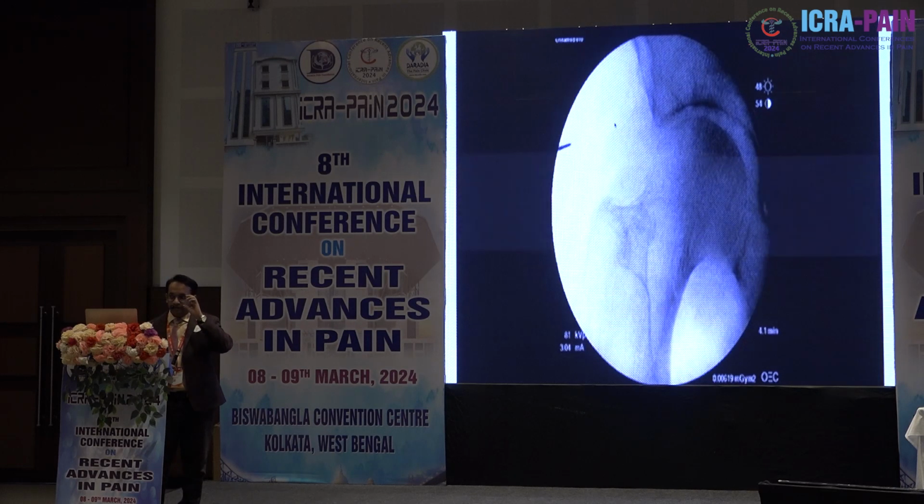Here we are going to target the acetabulum, the upper portion over here. Where my laser is pointing is going to be the target for it. We are going to use a fluoroscopic approach. Of course, I always combine the approach with an ultrasound as well. This is called a hybrid technique, which helps us stay away from the vasculature. Preferably we are going to go from a lateral to medial direction. I'll be playing this video.